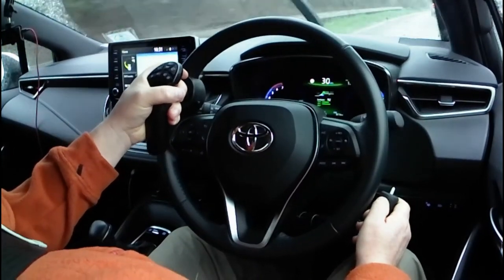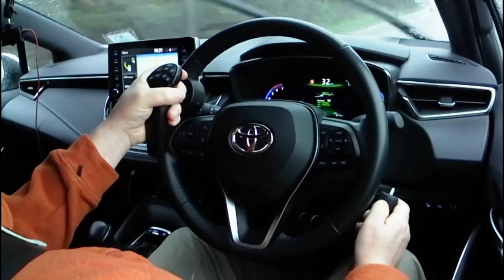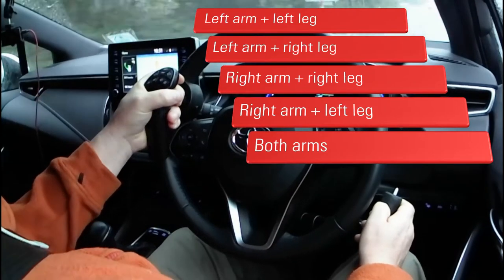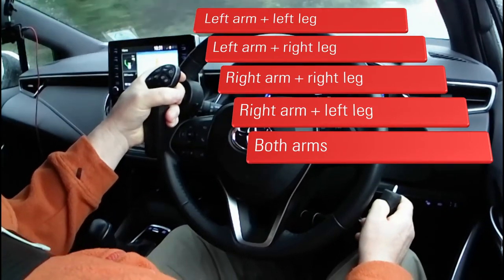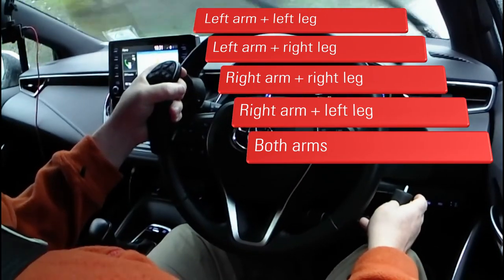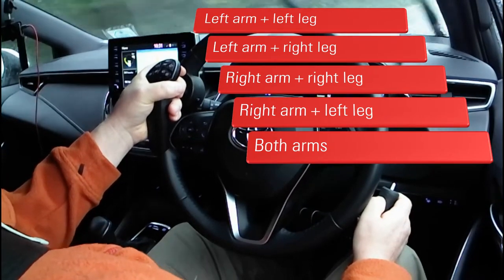To drive this car, you need two limbs, one of which must be an upper limb. So you can drive it with one arm and either leg — that could be left arm or right arm, and left leg or right leg. Or you can drive it with two arms.